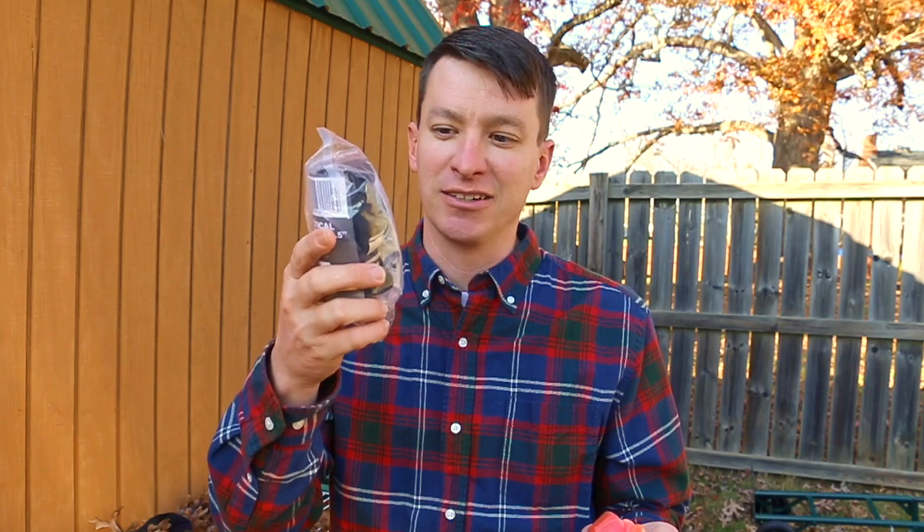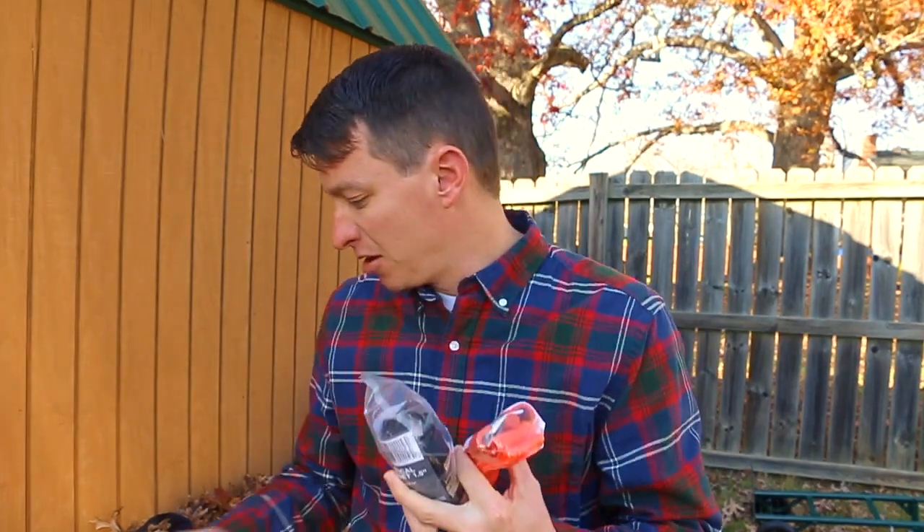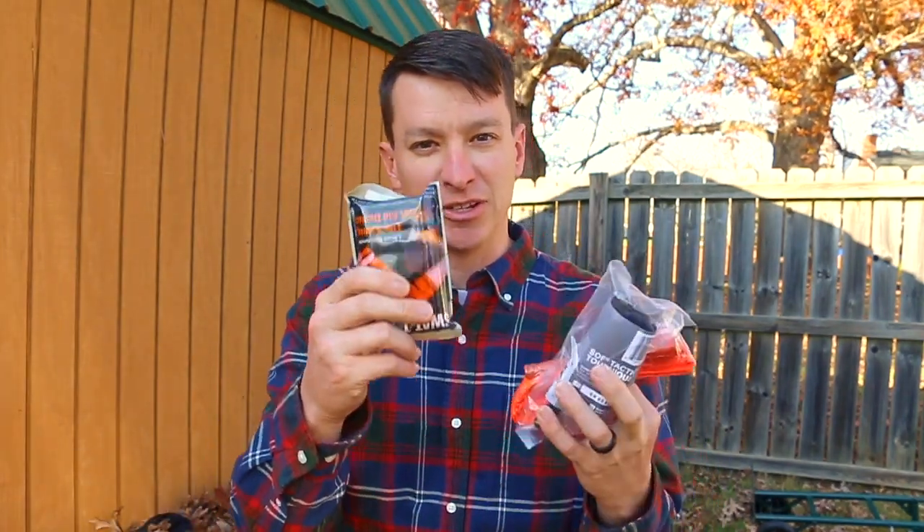A lot of guys do choose to leave their tourniquets in their packaging to protect them. I understand that mindset, because you think about things like snow, wind, and sunlight — leaving them in their packaging will help protect them from those elements.